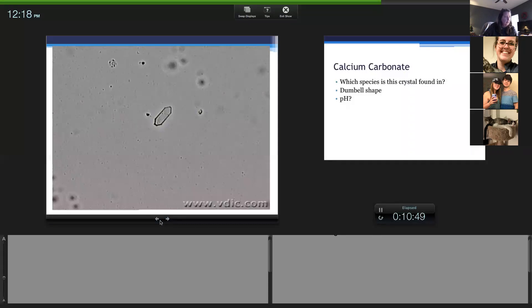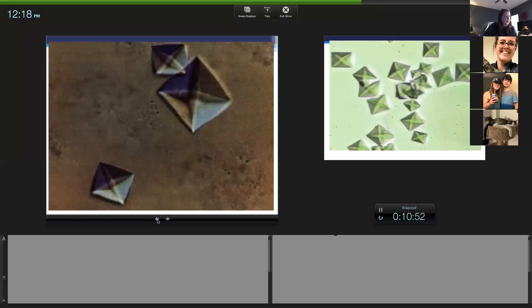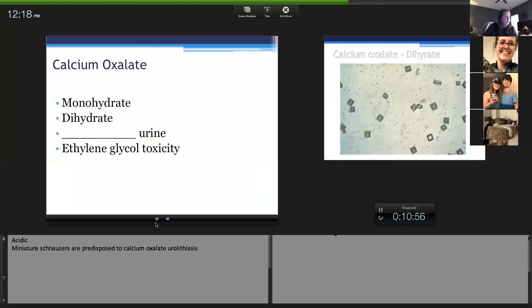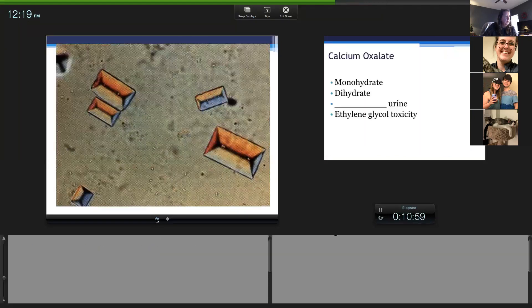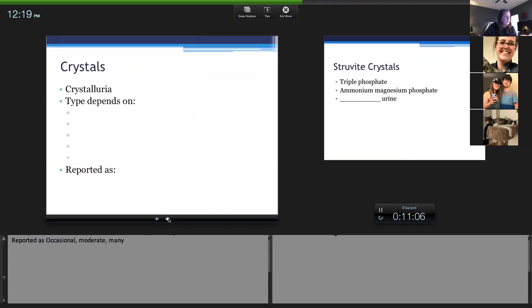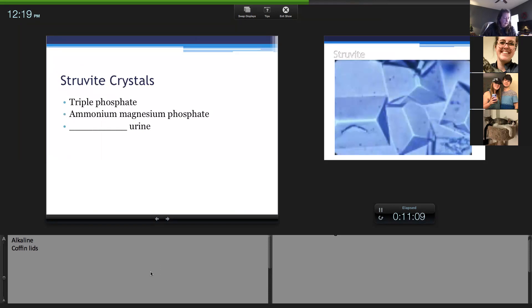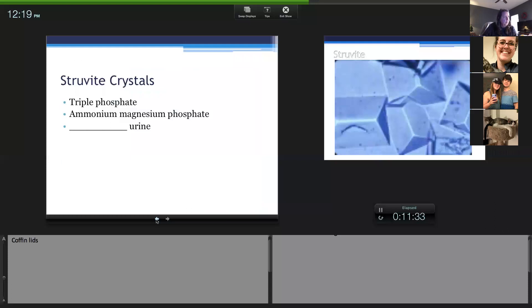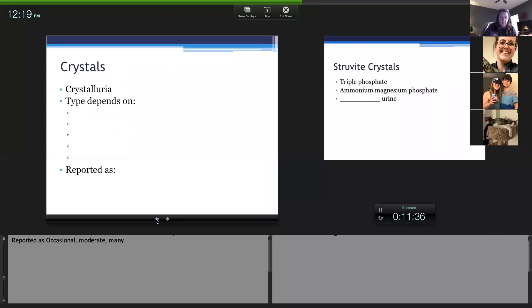This crystal is known as magnesium ammonium phosphate or triple phosphate. This would be your struvite crystals. Struvites can be triple phosphate versus ammonium phosphate, but this is also alkaline. These are the coffin lids and they're probably the most common crystal. This would be your struvite. Is there a question on the crystals?